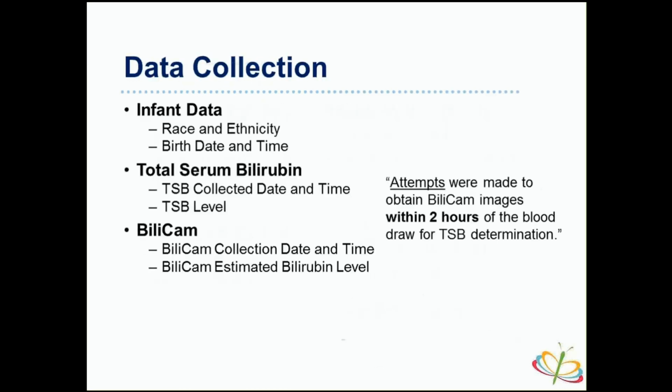Data collection: some key points collected were race and ethnicity of the infant, and obviously the date and time of birth. We wanted to know the collection date and time for the serum bili as well as the BiliCam bili, and those 2 estimated values. And as described within the article, attempts were made to obtain BiliCam images within 2 hours of the blood draw.